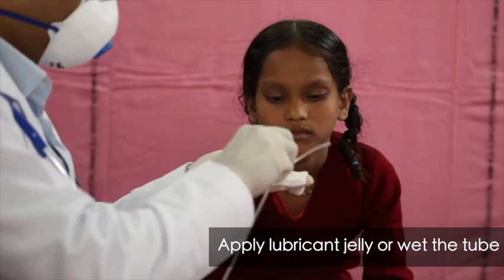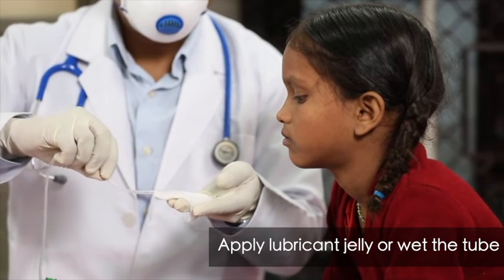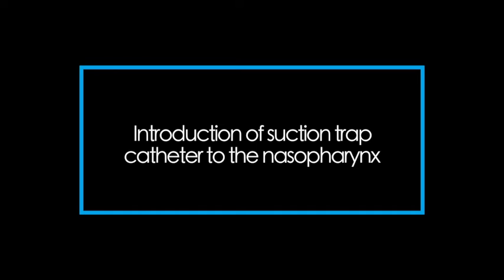Apply lubricant jelly or wet the tube. A few children get scared, however, this procedure is not painful as evident in another patient.